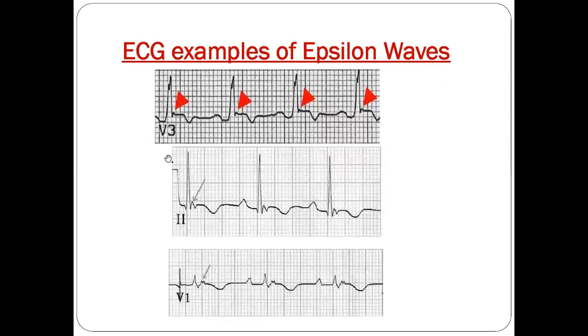Here are examples. After the QRS, if there's a small blip, you can see here also a small blip here and then another blip here. These are all features of what is called epsilon waves.